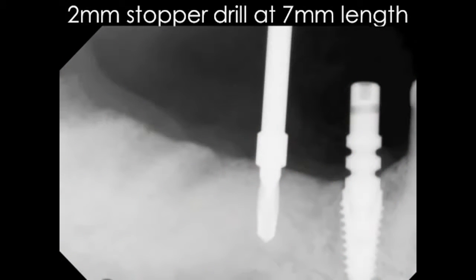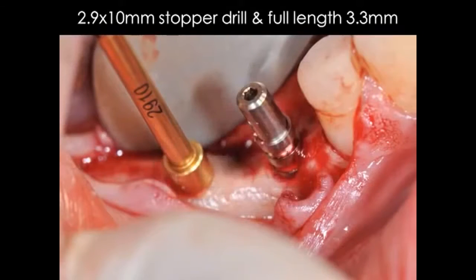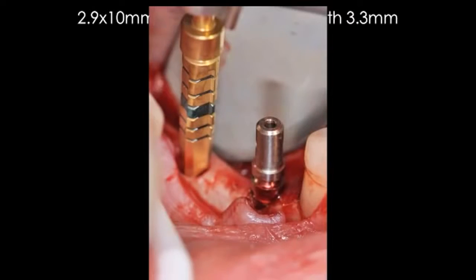As you can see, there's a 7 millimeter stopper drill nicely in place. You can see the depth of the implant platform with your pathfinder in place. But note the different peaks and valleys of the bone itself. So again, we're going to over-prepare the osteotomy slightly due to the implant length of the adjacent implant being a little bit deeper, so we had to do that with that particular drill.